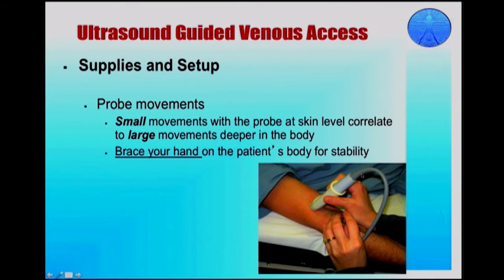People typically begin holding the transducer up near the cord because down here is that ultrasound jelly, and they don't want to get their hand in that ultrasound jelly. But if you hold the probe up high, you have very little control, and this procedure takes a lot of fine motor control. So the lower you can hold it, the better. I typically hold it right at the face of the probe so I can feel the skin and the probe at the same time.